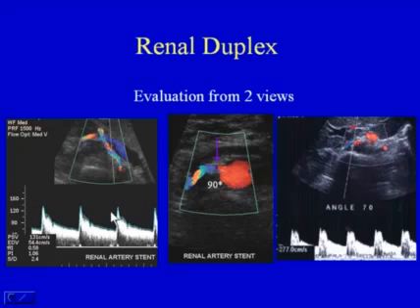Evaluating the renal arteries from two views, we will have multiple Doppler angles. However, if the Doppler angles are less than 60 degrees and the exam is consistent with stenoses from both views, the accuracy goes up. If you have a normal velocity from one view, and in this case we can see from the lateral decubitus approach, the right renal artery has a velocity of 131.